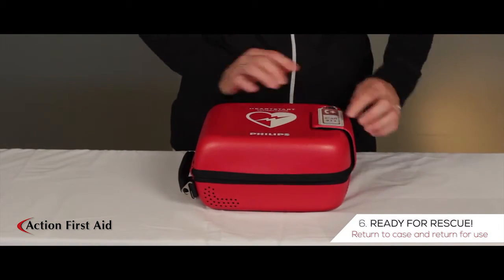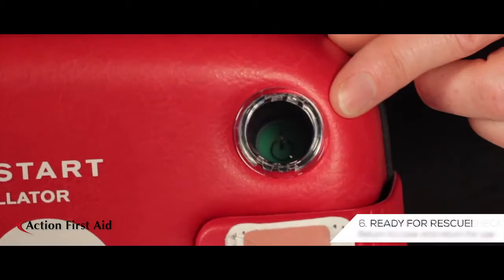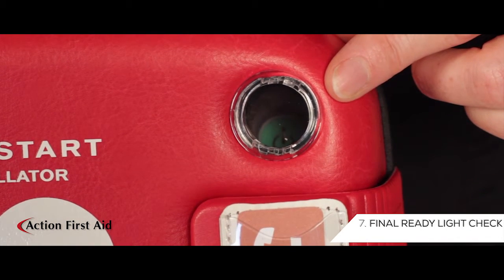The AED is now ready for rescue. Place the machine back in its case and return for use. Please ensure that the green light is visible through the porthole window.